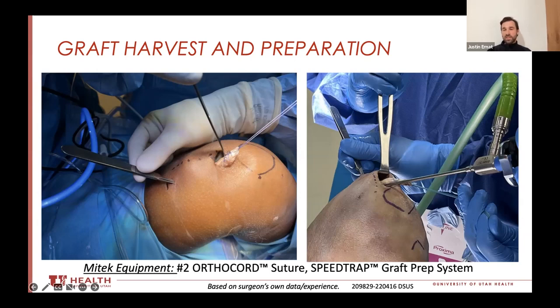The order of fixation is: I actually pull it into the tibia first by having over-drilled that. What that does is over-pull it into the tibia so it's easier to deliver up into the femur. I deliver it to the femur with a rigid loop BTB button there and tension the button so the graft is all the way in the femur, guaranteeing I have 15 millimeters in that femur. Then I have my 30 in the joint and 20-plus in the tibia.